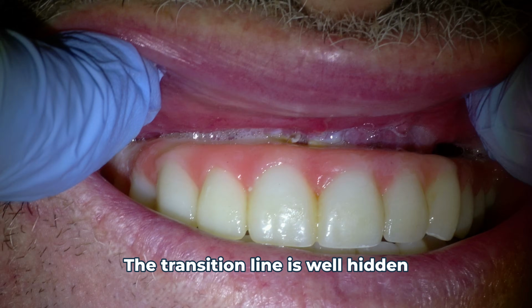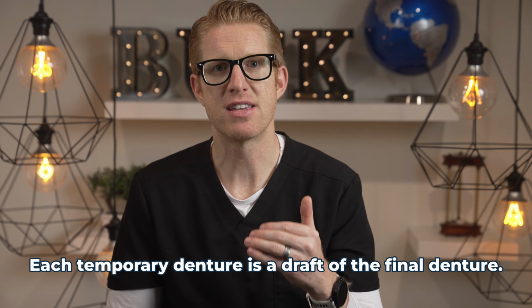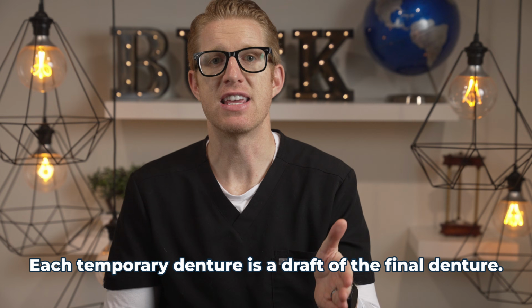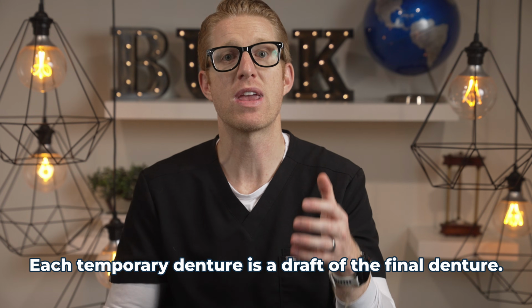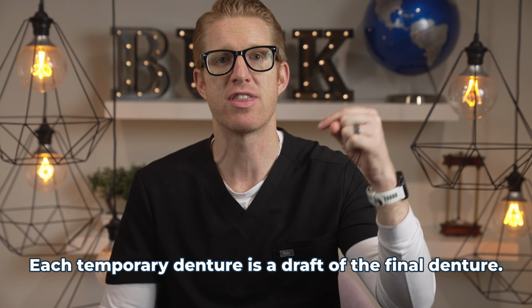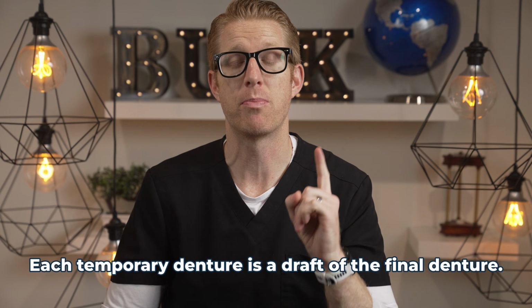With other methods, you have to start all over if you want to make adjustments to the design. But here with this process, we can just bring them down a little bit in the software and use a new shade and make a new set of teeth to try, and as we make new ones, this will ensure the patient likes the final product before we even make the permanent dentures, because they will be patterned after this design. Other methods, each new set is a completely different design, including the final permanent set.